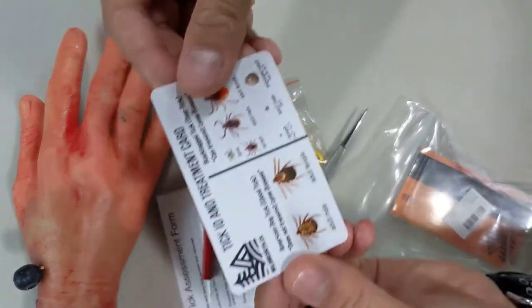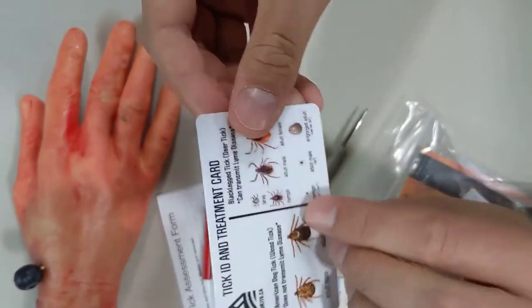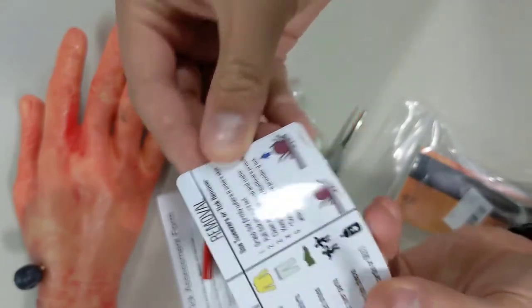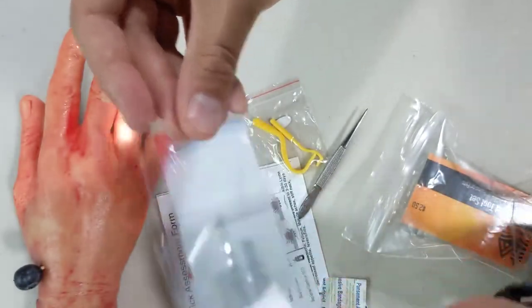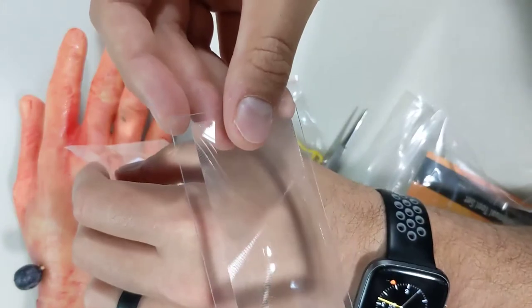The kit includes a tick identification card that helps identify dog ticks from black-legged ticks, with prevention tips on one side and how to remove the tick on the other. There's also a magnifying glass or Fresnel lens to help get nice and close to identify if you got all the tick pieces out.